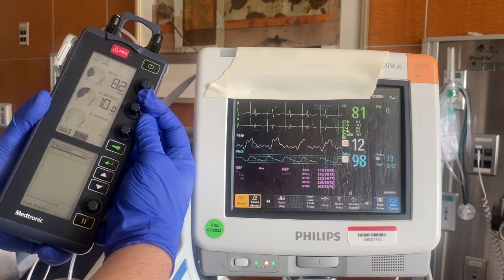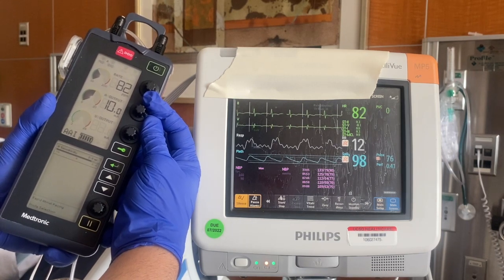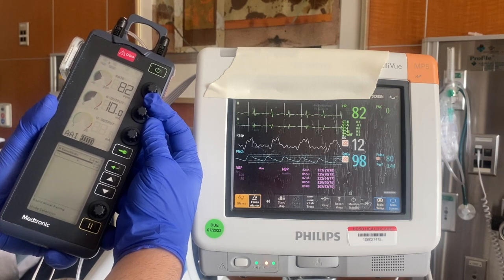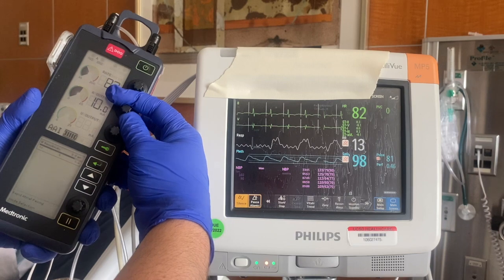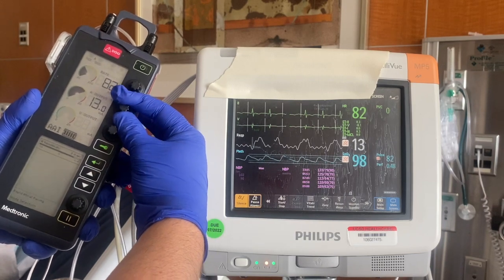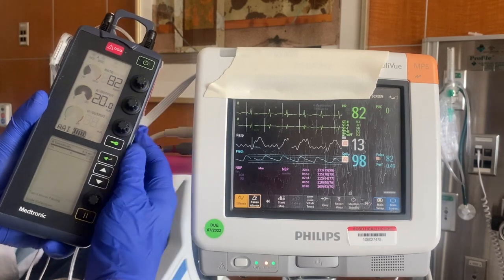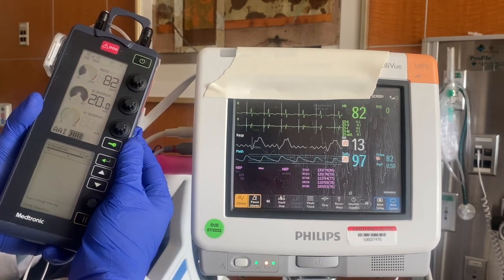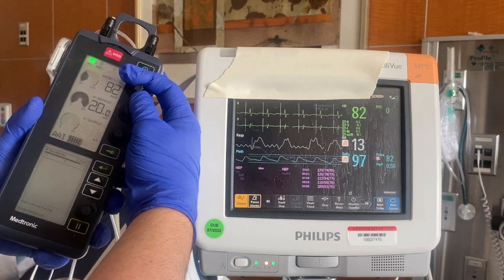Currently the pacer box is at 10 milliamps — this is the threshold. You will set the milliamp output to two times greater than the stimulation threshold; in this case it will be up to 20 milliamps. You want to now restore the heart rate to the previous setting — our previous setting was at 94.